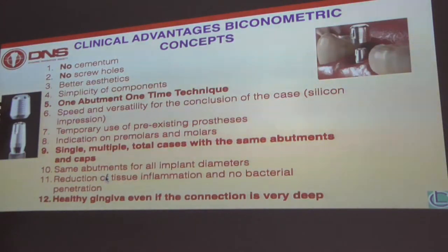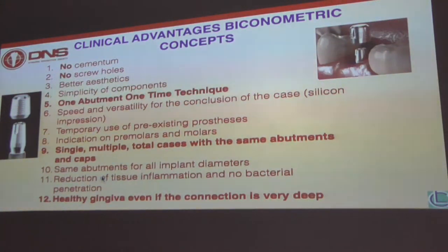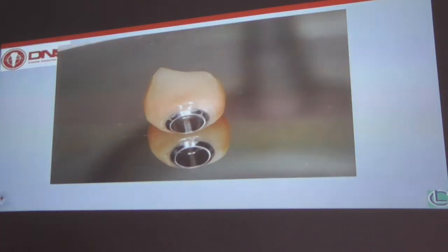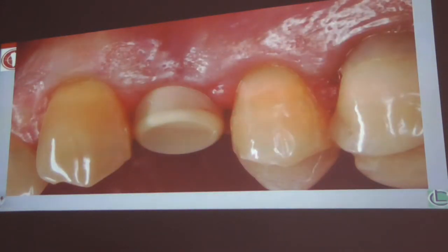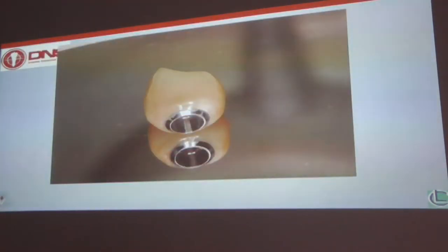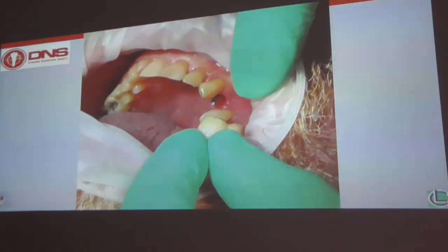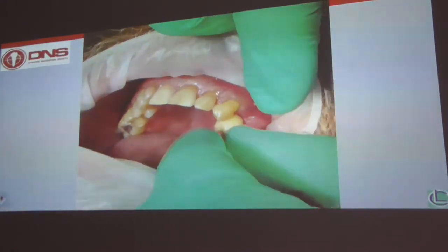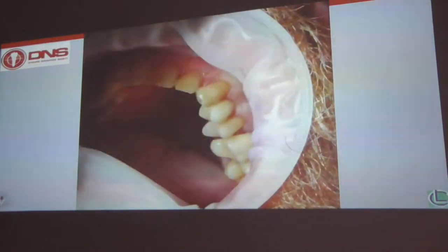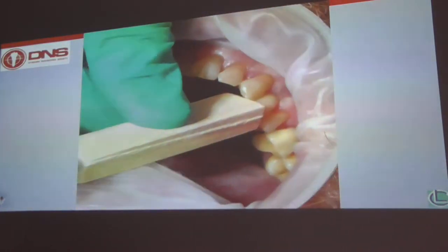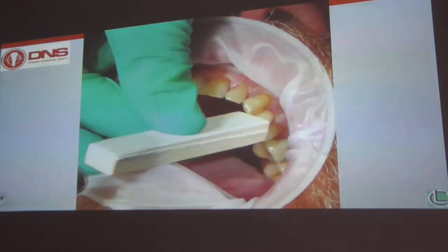I use the conometric connection with caps on the abutment all the time. I glue it — it can be porcelain, zirconia, or metal — into the cap, and it connects by friction only to the abutment. This reduces inflammation and you gain healthy gingiva. For example, this is a disilicate crown glued on the cap. This is the healing from the PEEK healing abutment, and that's the final crown. You just glue the crown and hammer it a little — it's not painful for the patient — to get the correct friction. The case is finished.